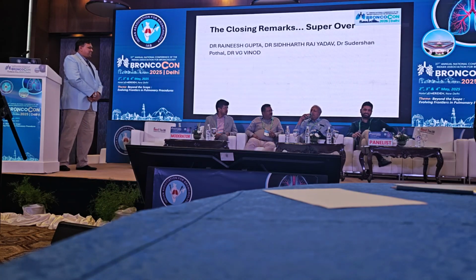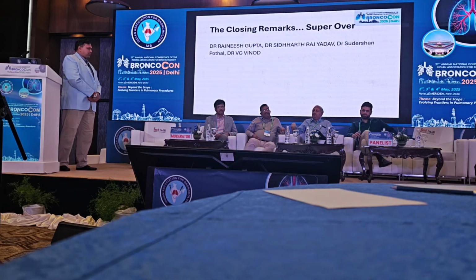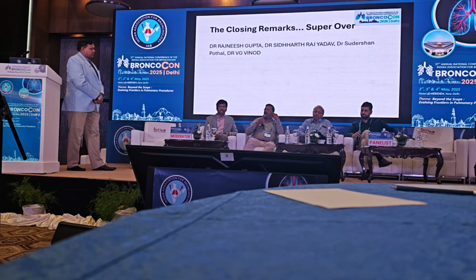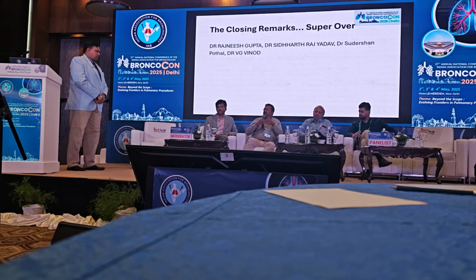So bronchoscopy can be safely done in a TB patient, provided we take certain precautions, select our patient properly, and rule out contraindications. BAL is a useful test which can provide diagnostic information. Because tuberculosis is endemic in our country, we should not forget the basic things, means sputum, TrueNat or CBNAAT. This is the first. Because if you are identified through sputum, there is no need of much more diagnosis as far as diagnosis is concerned. Yes, as far as therapeutic is concerned, particularly if there is some sort of stenosis. But the basic thing before doing bronchoscopy, sputum or TrueNat or CBNAAT, is the most important.